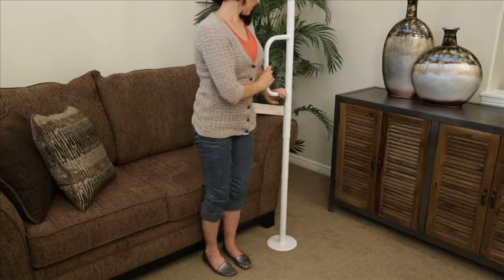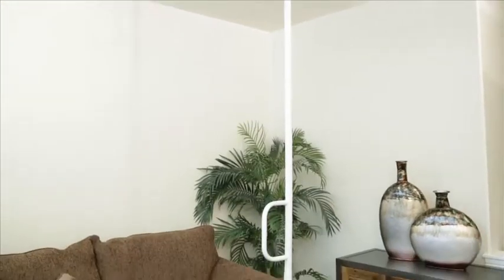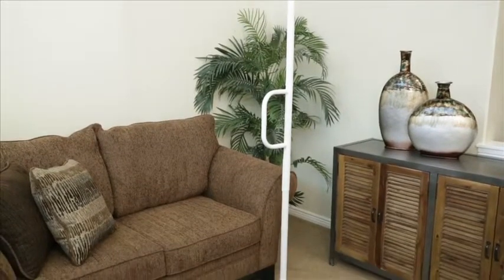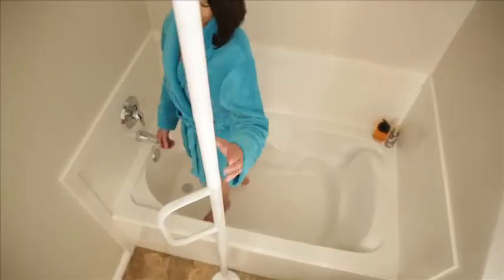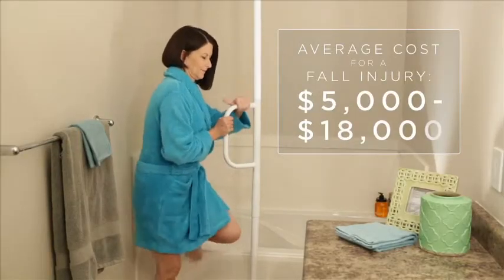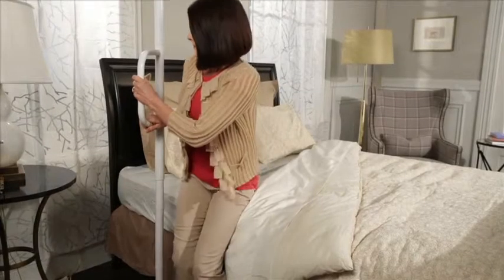this grab bar can be installed anywhere in your home without drilling screws into your floor or ceiling. It installs in minutes with the included wrench and can be secured in any room with a seven to nine foot ceiling. So whether you need support while standing or extra stability while getting in and out of the shower, the Universal Floor-to-Ceiling Grab Bar from AbleLife can prevent costly injuries and give you the support you need to stand with confidence.